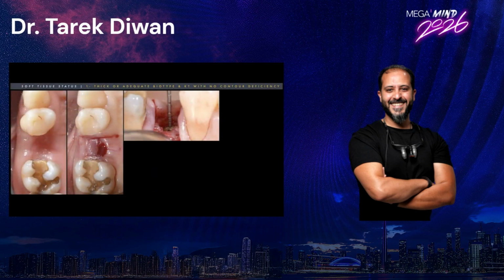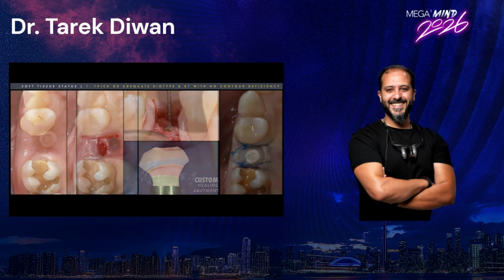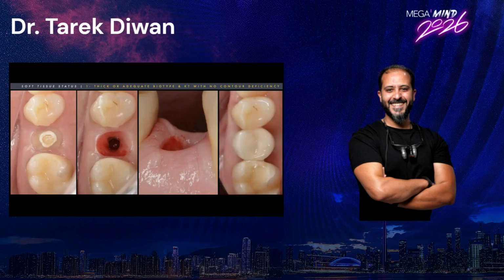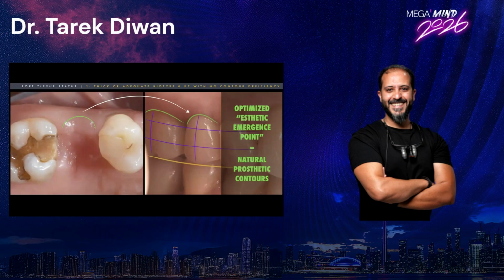Following such protocols on the day of placement, sparing the papillae, placing the implant in the ideal 3D position, and securing a customized healing abutment on top of the implant, will help me in 3 months' time create the perfect emergence profile and tissue architecture that is ready for final scans, and then we proceed with the final crowns. Thanks to that kind of tissue, I can restore the tissue with ideal prosthetic contours.